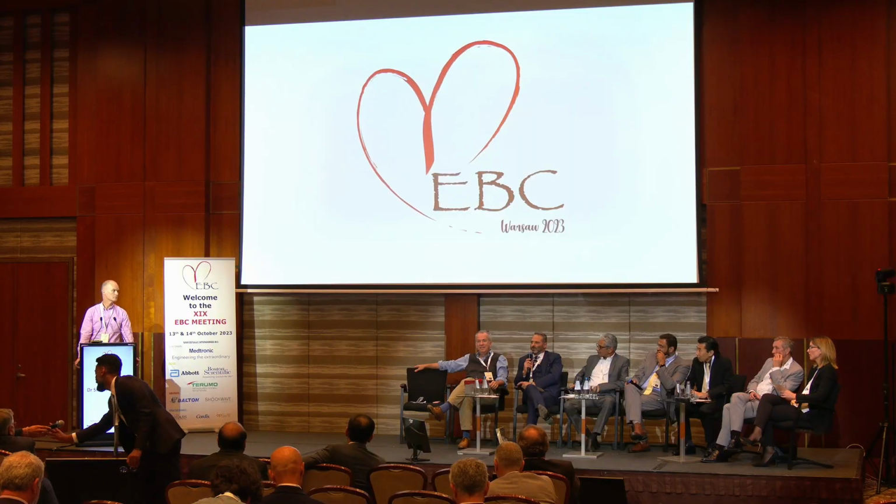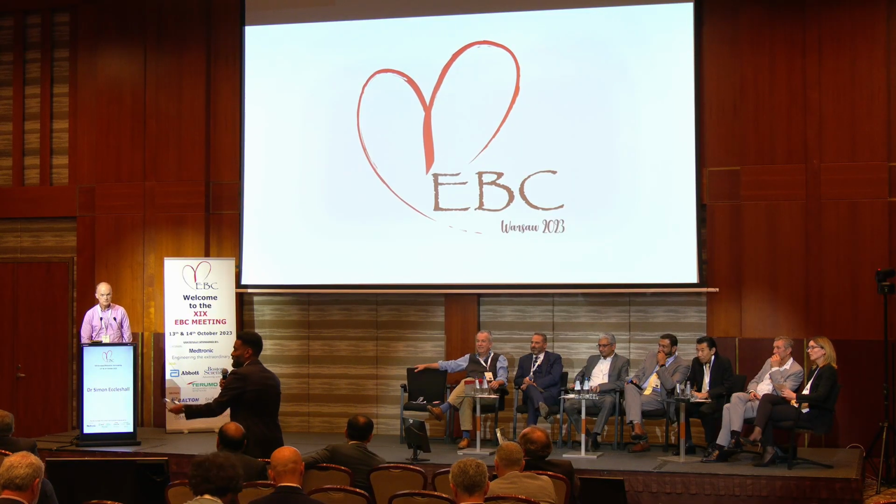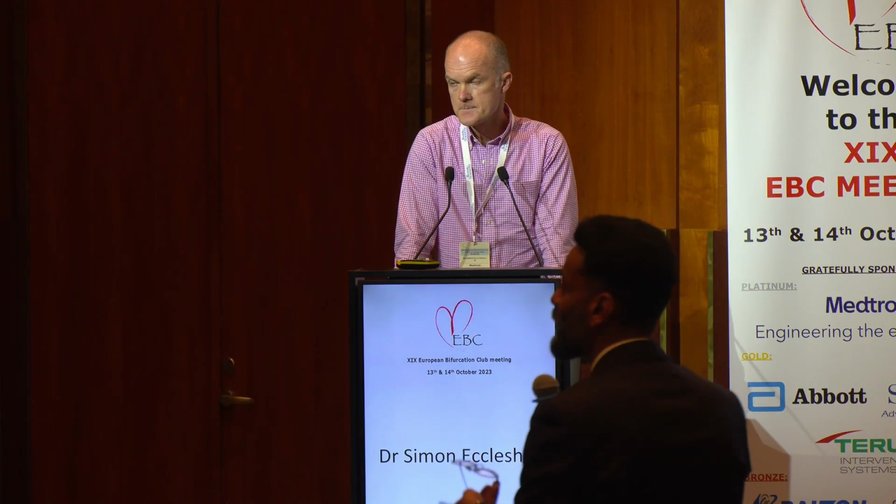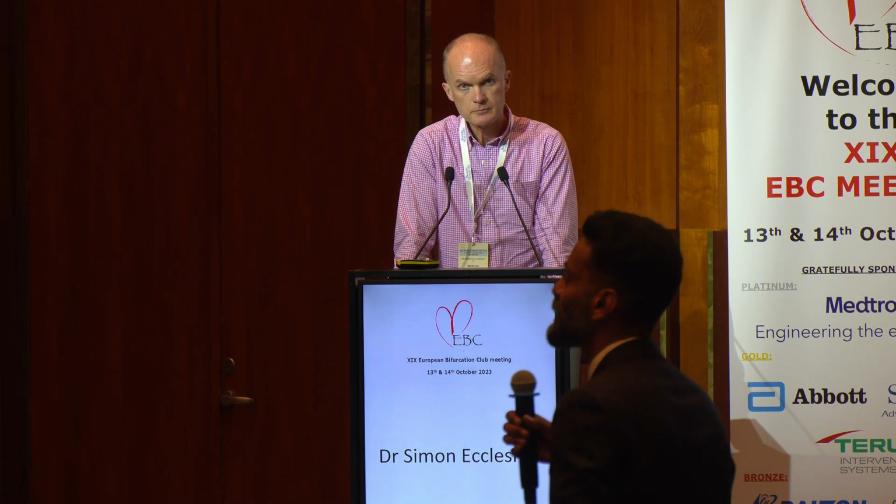Just a couple of short questions, just learning from Dr. Colombo, as we have so many here. He says that the decision to use a DCB should be after the pre-dilatation. So if you have a good pre-dilatation result, you can think about DCB. So why should a trial not be designed where we randomize after the pre-dilatation? You do a pre-dilatation, and if there is a good result with no dissection, good lumen gain, then you randomize to the DCB arm versus a DES arm. Because sometimes in these trials, we see patients where DCB is going to fail. There is a long diffuse calcified lesion and it gets randomized to the DCB arm. Why not randomize after pre-dilatation to a DCB versus DES arm?